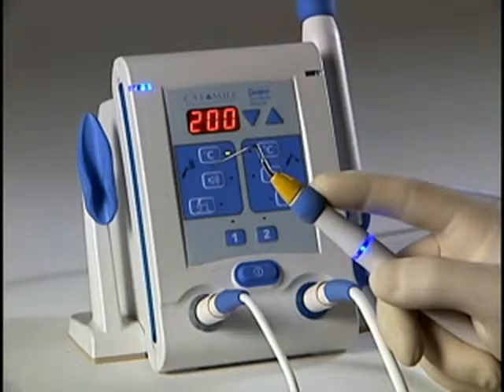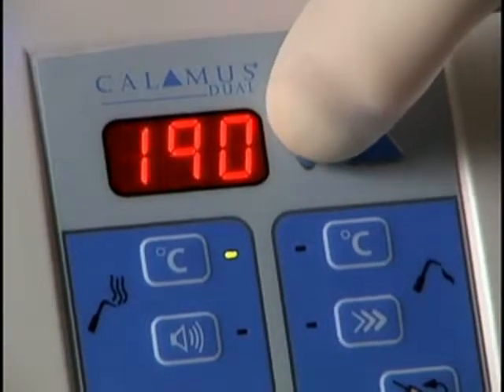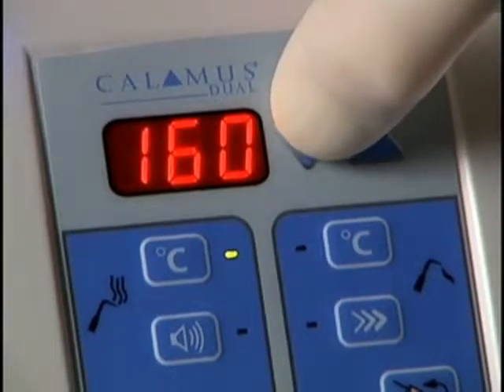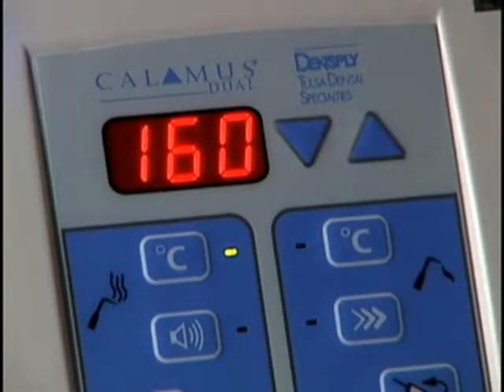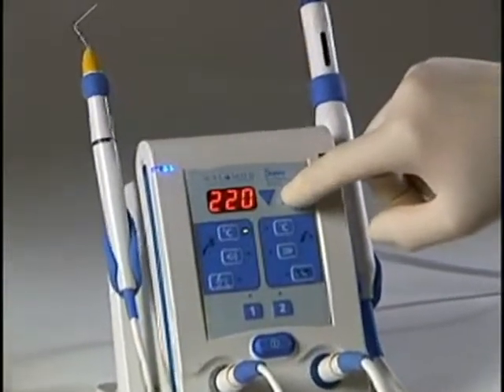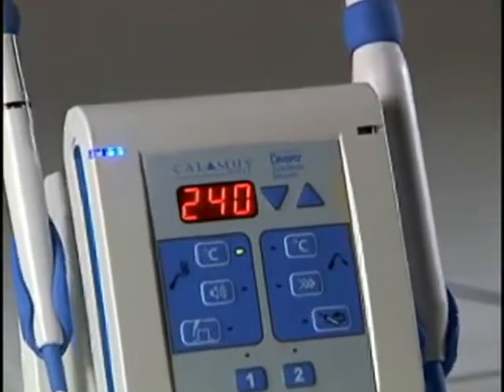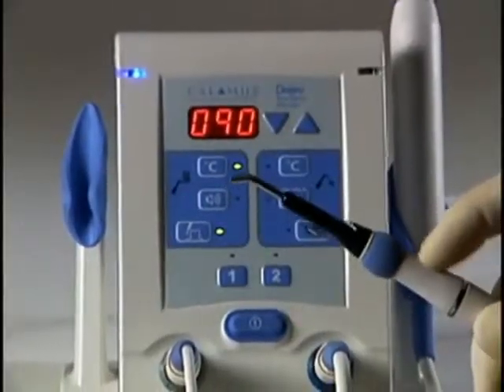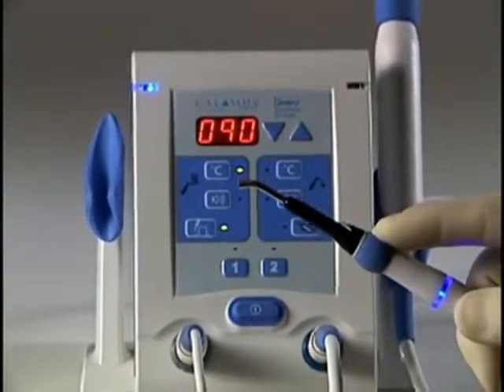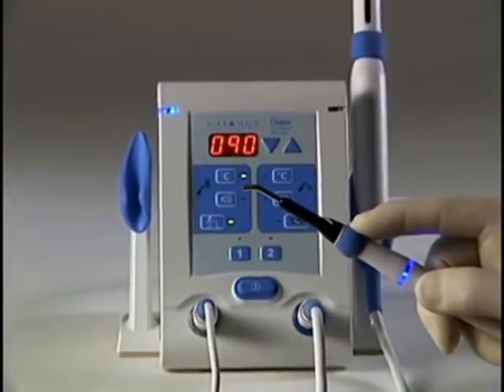When pressing the activation cuff, the tip will heat for 15 seconds for temperature settings of 200 degrees C or lower. The tip will heat for 10 seconds for settings above 200 degrees C before timing out. The thermal response tip will heat for 1 minute while the 360 degree activation cuff is depressed.